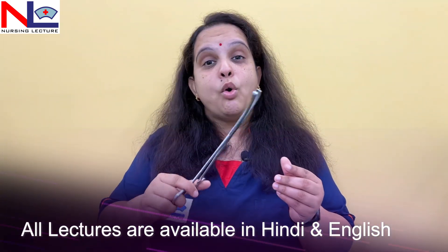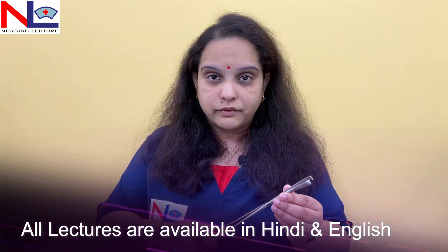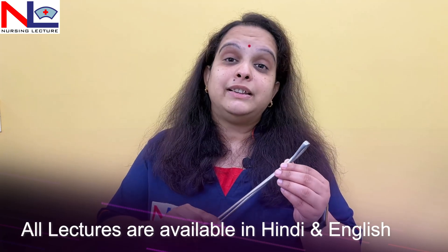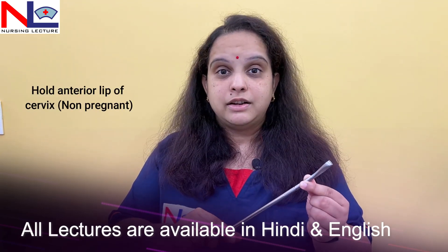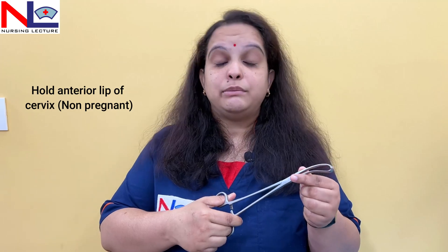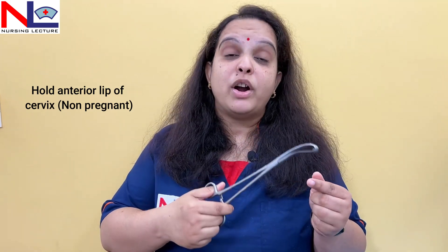On the tip of the blades there are multiple teeth to hold tough tissues. This instrument is mainly used for holding the anterior lip of the cervix. It should not be used while the woman is pregnant, because during pregnancy the cervix is extremely soft and using this traumatic forcep may cause heavy bleeding.